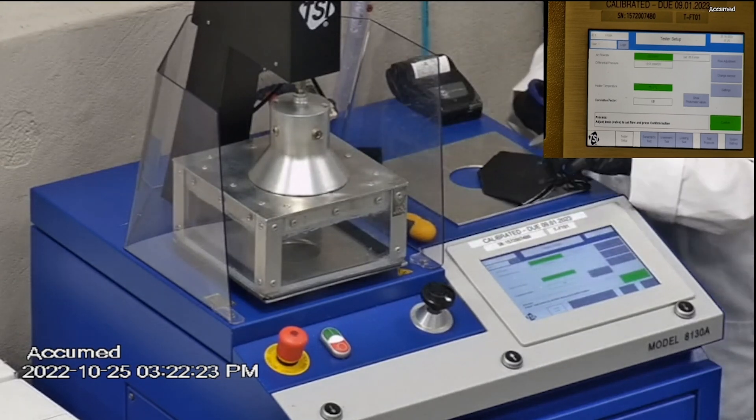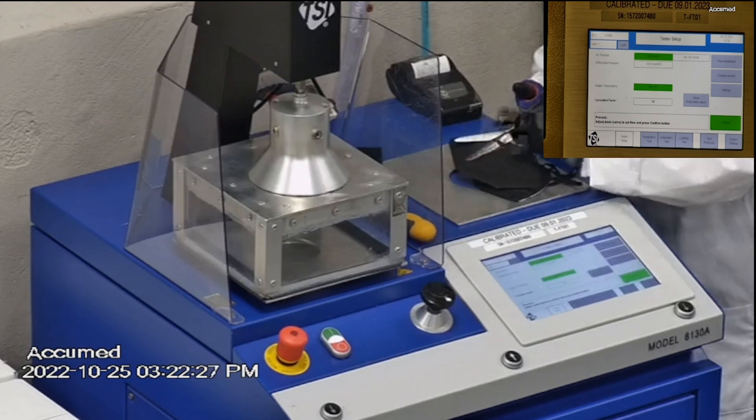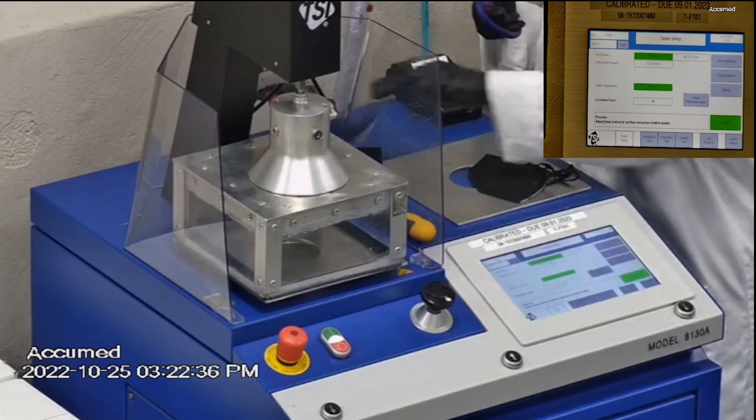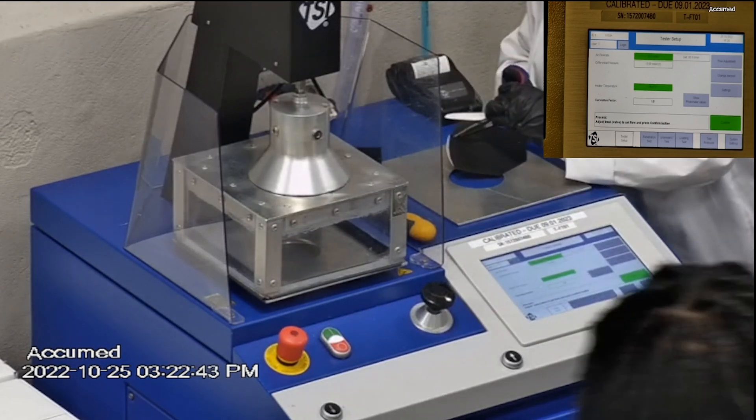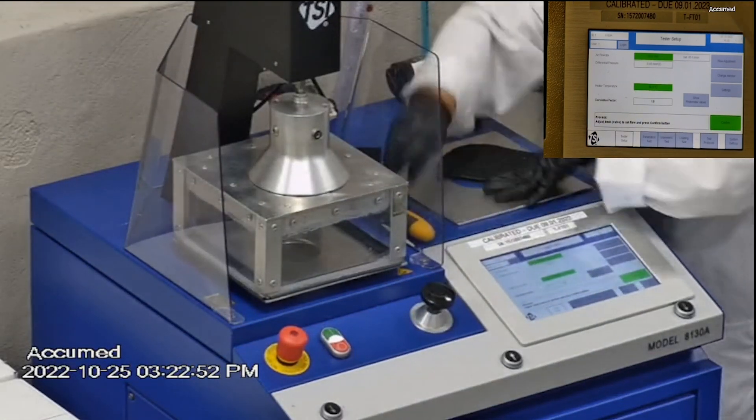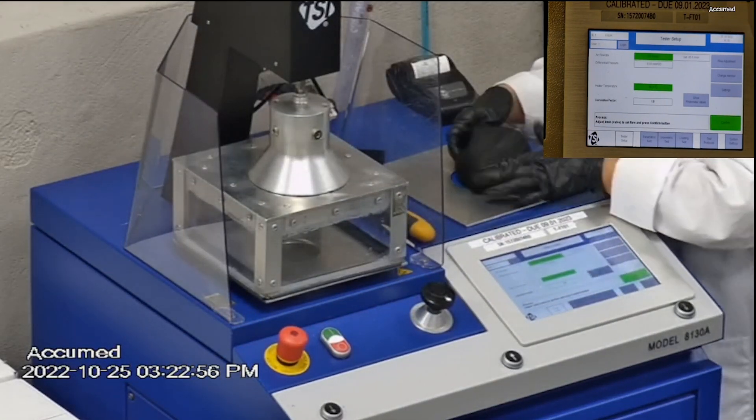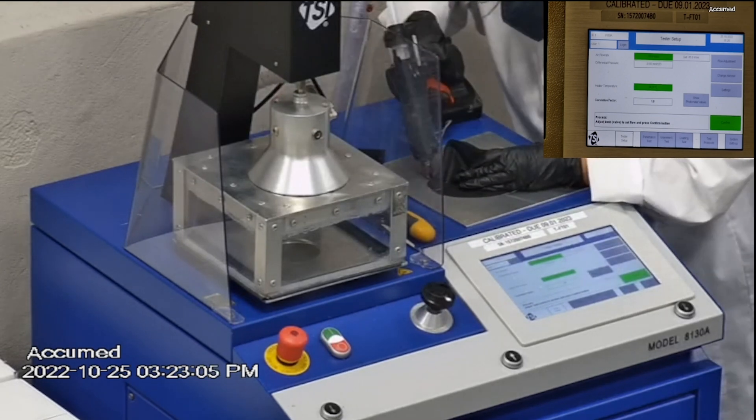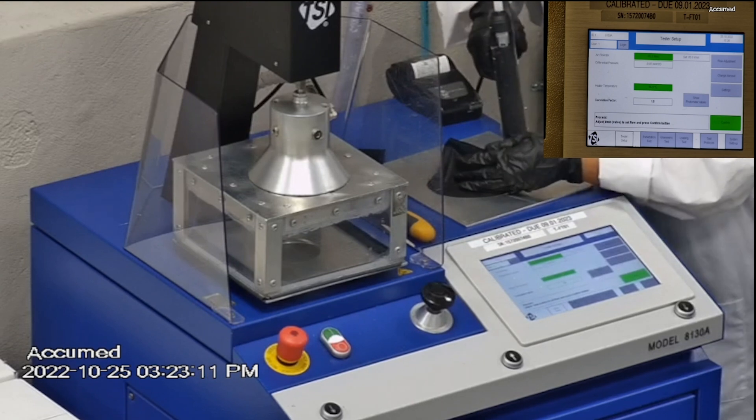Our procedure is also inspired by NIOSH. We first run the tester setup and start removing the ear loop bands from the mask before placing it on the testing plate to ensure a proper seal. Then we make sure that the mask is properly and completely sealed with hot glue to the testing plate. When applying the hot melt glue we make sure that there is no holes or leakage around the seal to ensure accurate results.